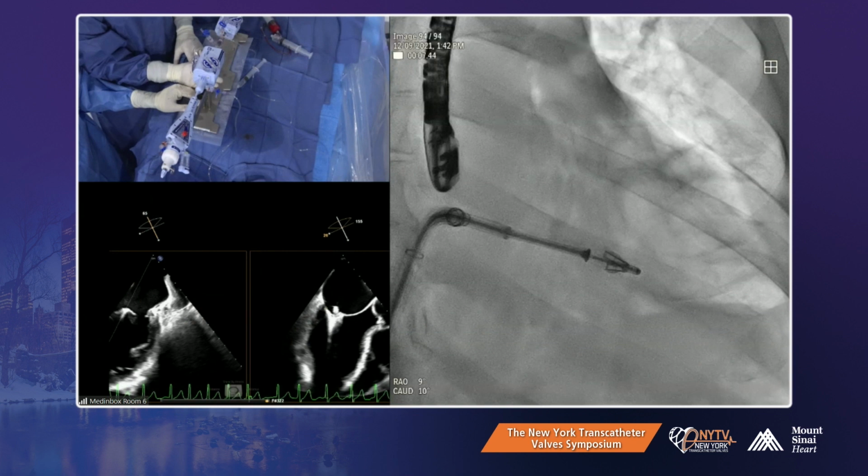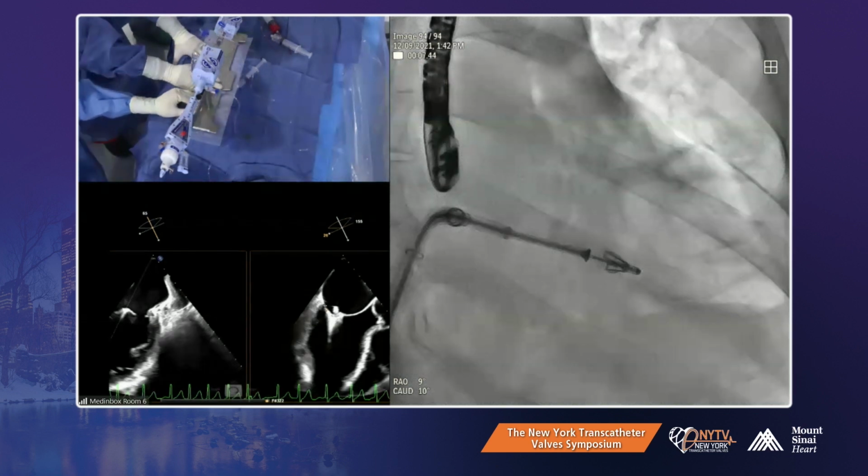We need to optimize posterior. What was the leaflet length again on this side? It was like 1.8. Posterior. See a frozen image here. We are measuring the residual leaflet length right now. Okay, all right, go live.